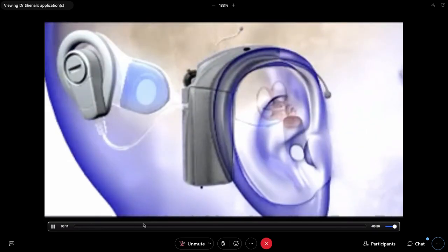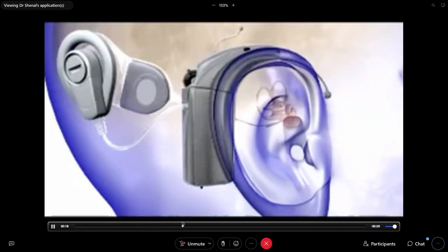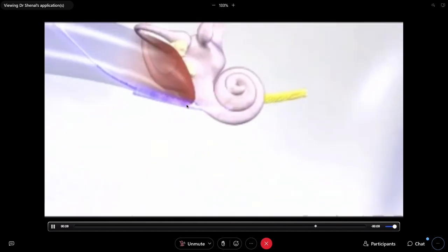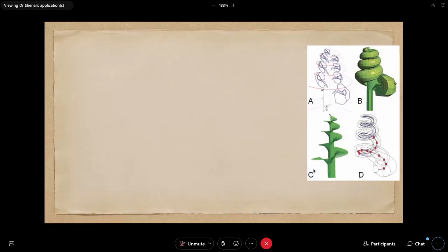But when you have a cochlear implant, what happens? There is an internal part and an external part that works. Whenever there is sound, the microphone picks up the sound, and the speech processor processes it into electric stimuli. Through the transmitter coil, it goes towards the receiver coil. From there, an internal circuitry transmits it further through the array into the inner ear. When there is a stimulus, the electrode will give stimulus and your nerve gets stimulated. That is how a cochlear implant works.